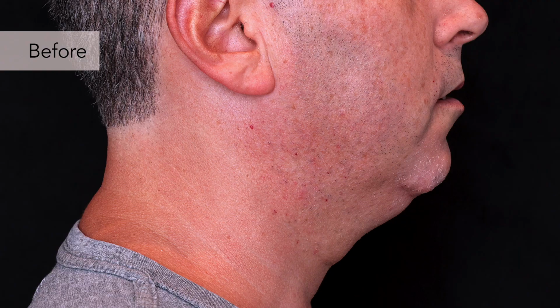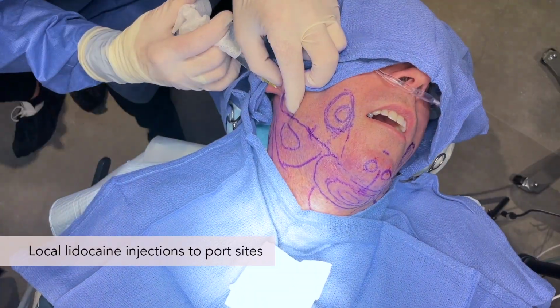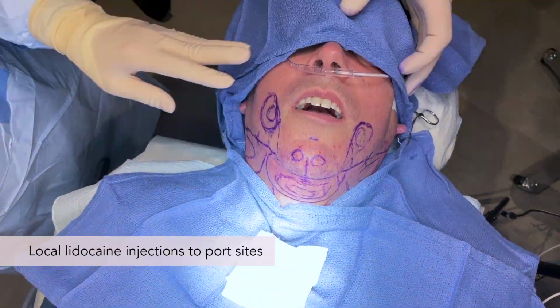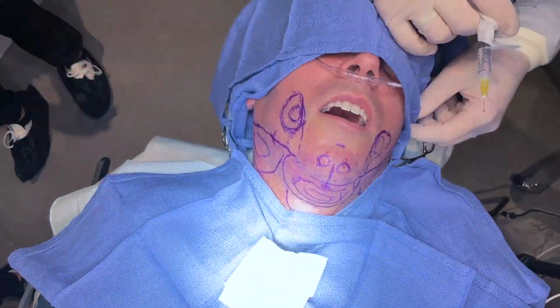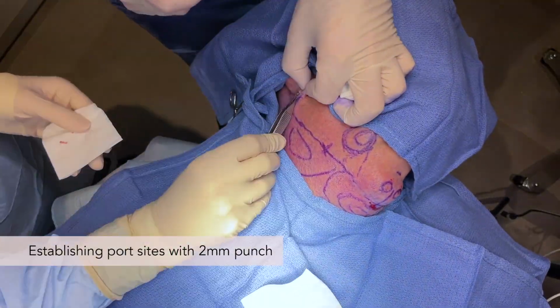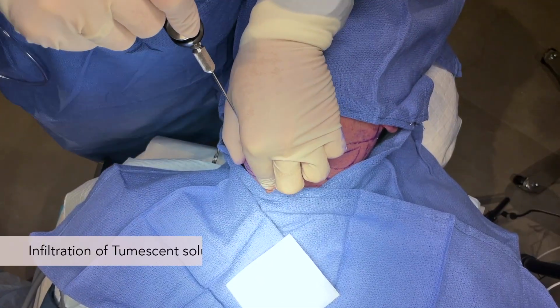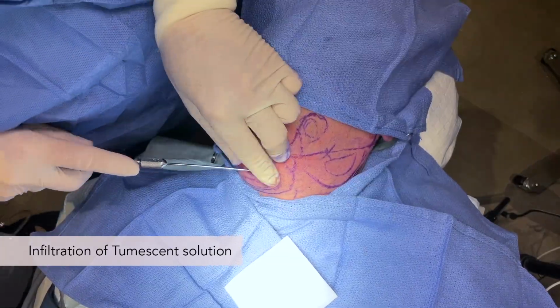Khorasani. In this video, I'm demonstrating submental liposuction with FaceTite radiofrequency. First step is local injections of our ports with lidocaine with epinephrine. Then we're using 2 mm punches in order to remove a tiny amount of skin so that we can insert our cannulas through the ports.